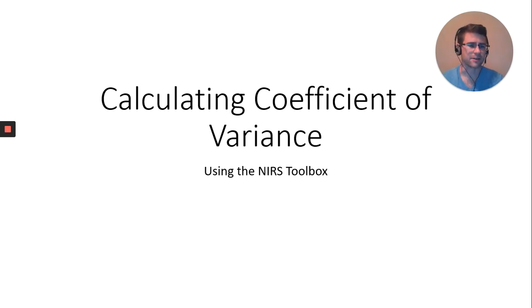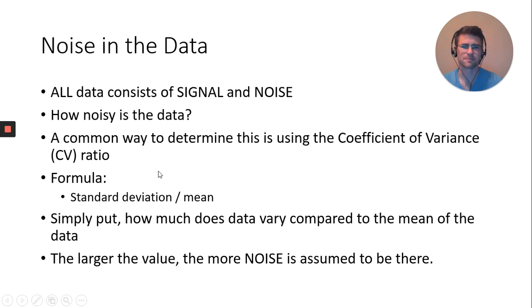It is incredibly fantastic and wonderful, but once you get into using it for multiple subjects, it can be a little bit tedious. Therefore, you may be moving into the NIRS Toolbox, among other reasons, for several uses of the NIRS Toolbox. In order to actually move this function over, you will have to use an inline script, but I would like to give you just a little background on why you would want to use this and what it's actually telling you.